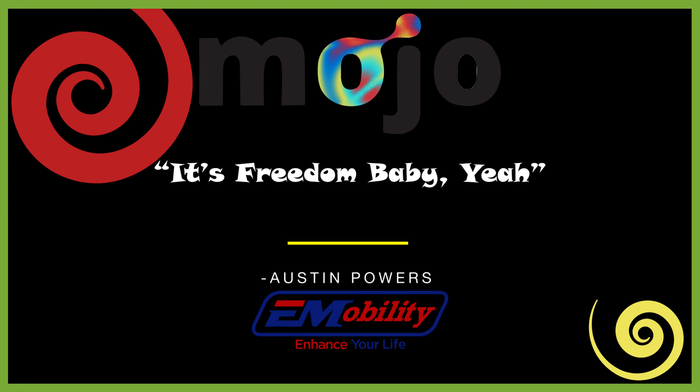I have used my Mojo on vacation, in stores, and all around the neighborhood. It's so easy to use. I'm really loving it.